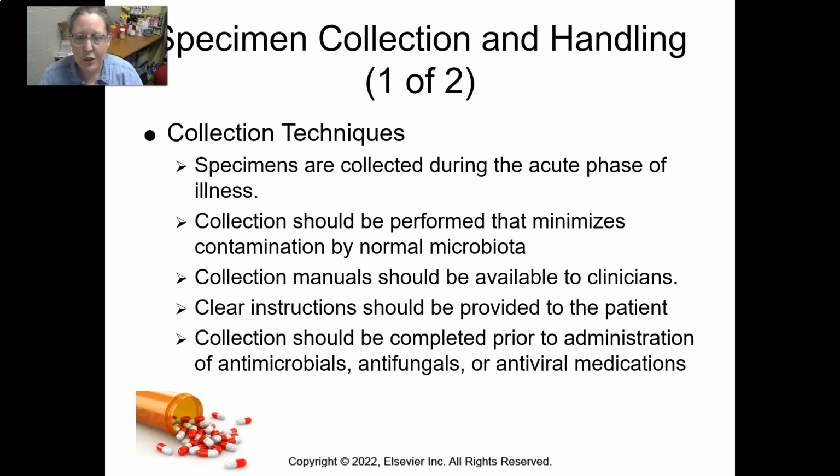There should be standard operating procedures written up for the nursing staff or for any clinician that may be collecting specimens. And if the patient has to collect a specimen, you have to give them very clear instructions on how to collect the specimen. The example would be the instructions you would give to get a clean catch urine specimen. And for the collection of specimens generally, we ideally want them to be completed prior to any kind of antimicrobial, antifungal, antibiotic, antiviral, like any of those things.